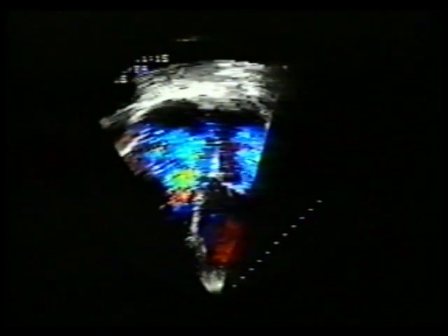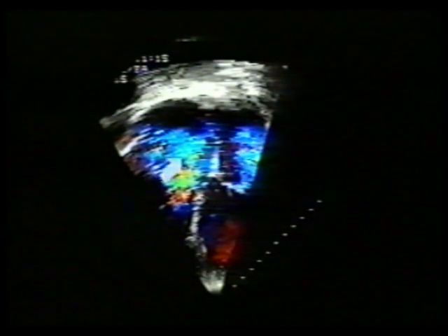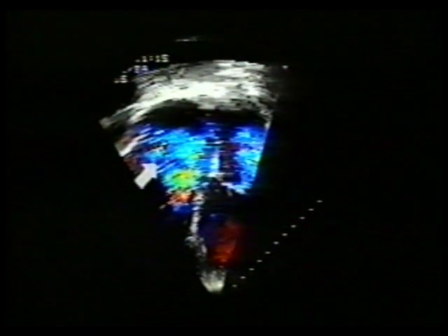Tricuspid regurgitation is also found in almost all patients with dilated cardiomyopathy. This patient has severe mitral and tricuspid regurgitation. We are now directing attention to the tricuspid regurgitant jet. In the real time sequence which follows, you will notice that the amount of tricuspid regurgitation is phasic. It lessens with expiration. But with cycles such as this, recorded during inspiration, the mosaic jet fills the enlarged right atrium.